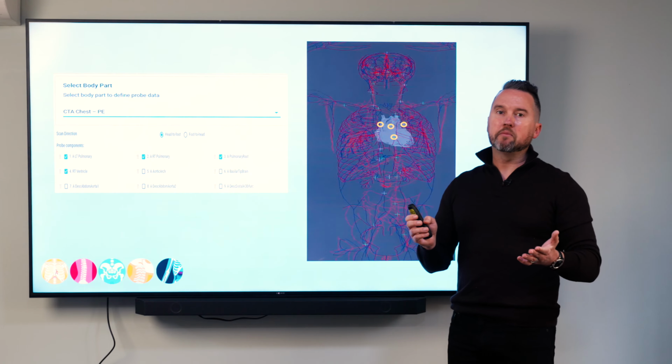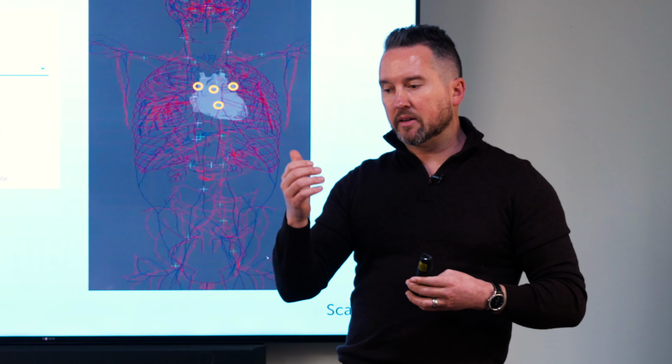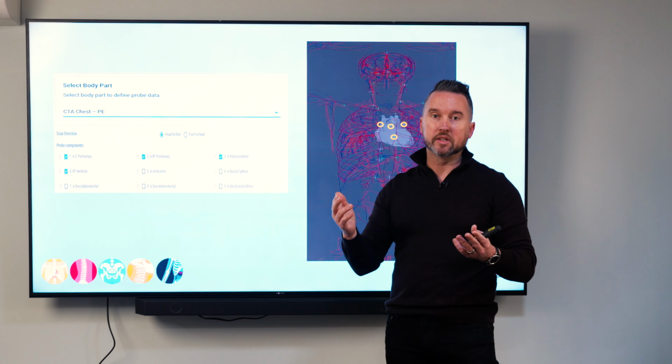And what do I really mean by quantify angiography? So if I'm giving a bolus of contrast, sometimes I'm going to be maybe early. Maybe the contrast has not arrived at the vessel that I want to image, and I don't get very good image contrast. I don't get good opacification of that vessel. Sometimes I'm right on time. That's what we always want to be. Sometimes I could be late, and so there's not enough contrast, or it's washed through and is now in the venous system instead.